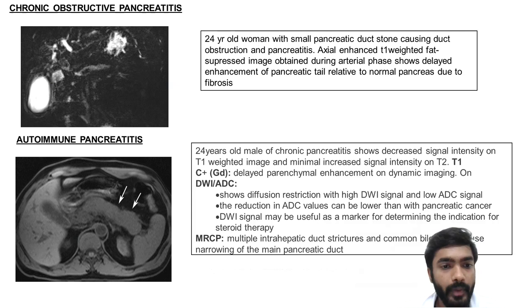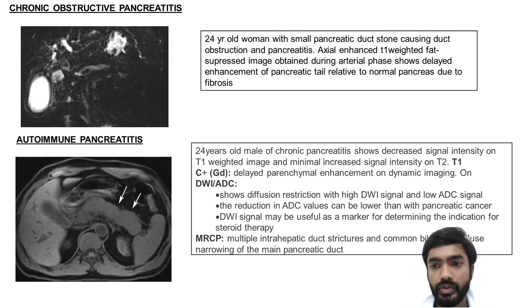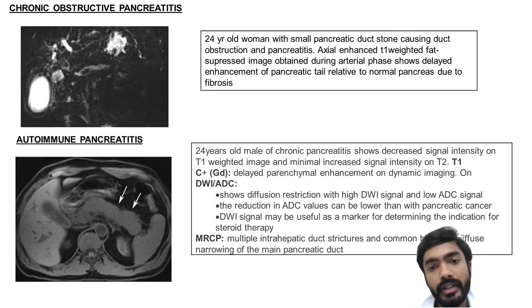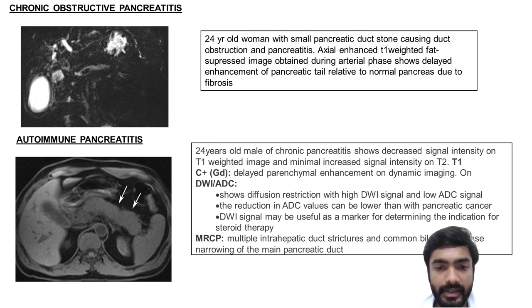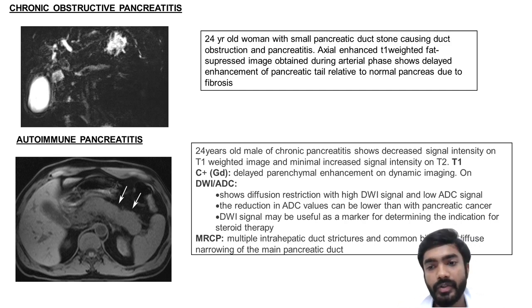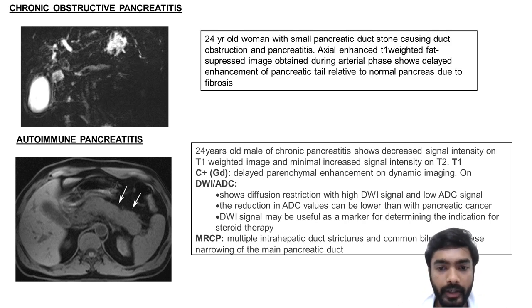This is a case of autoimmune pancreatitis showing a sausage-shaped pancreas in a 24-year-old male with decreased signal intensity on T1-weighted images. On T1 gadolinium images, delayed parenchymal enhancement is seen on dynamic scanning. On DWI and ADC, restriction is seen with high DWI signal and low ADC signal. On MRCP, multiple intrahepatic duct strictures and common biliary duct involvement with diffuse narrowing of the main pancreatic duct can be seen.